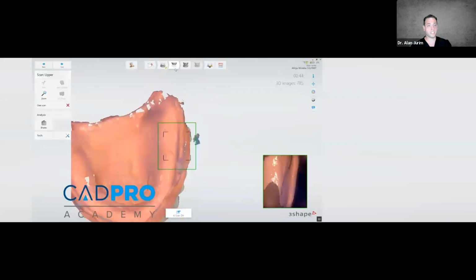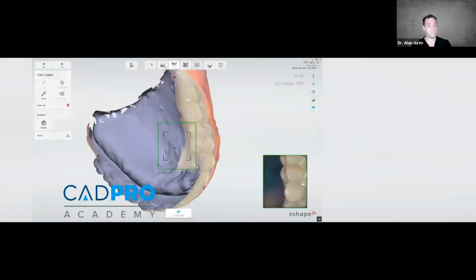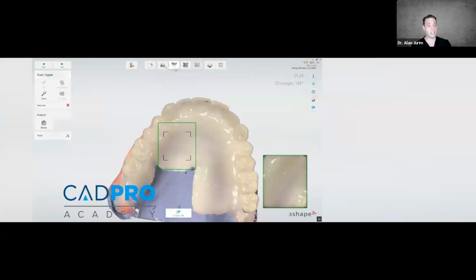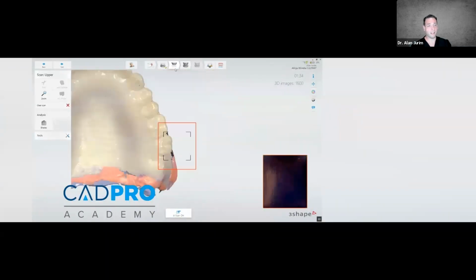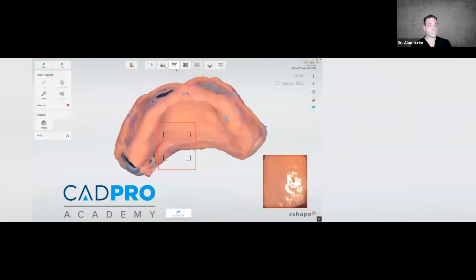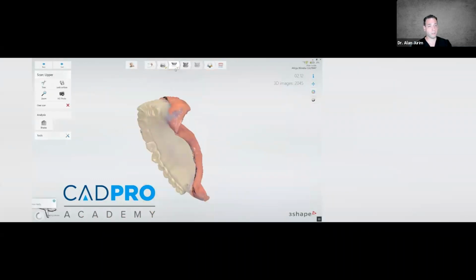We'll immediately digitize it. This is the actual video of her doing this. This was right before the pandemic, I believe. We do a lot of these style cases, and this just happens to be one of the last cases that we had done. So we'll go ahead and digitize the realigned denture at this point.